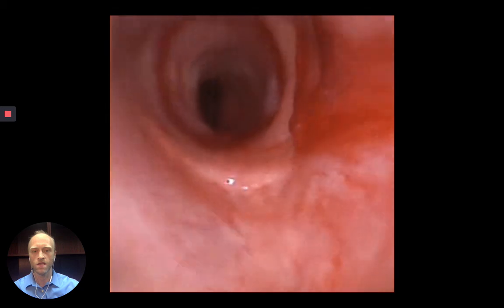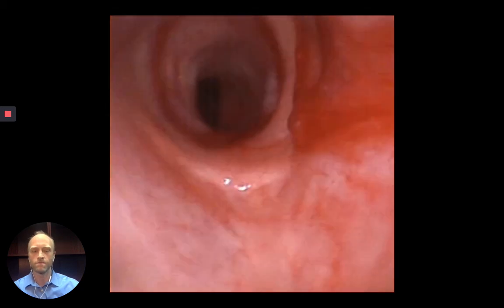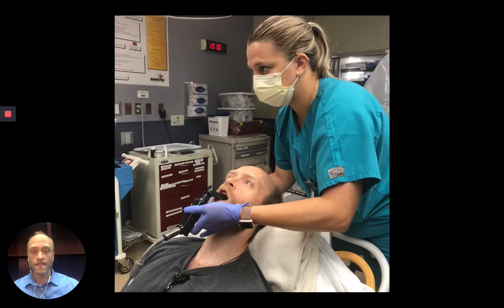And another successful intubation. As I mentioned, you can also use a video scope. When using a video scope, it is vital that you obtain a dense block to the posterior tongue and epiglottis, as those are going to receive pressure. So you want to position the patient in a semi-recumbent position with the intubator toward the head of the bed just to the patient's left.